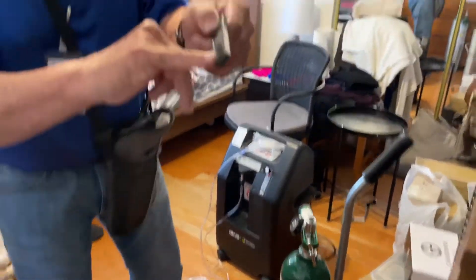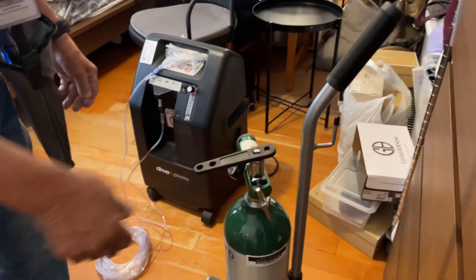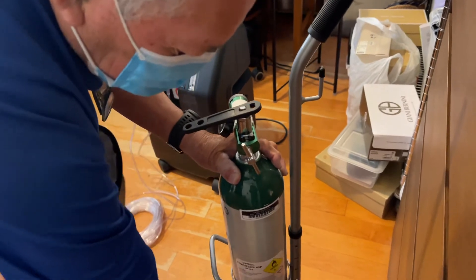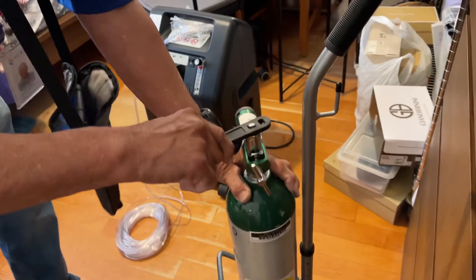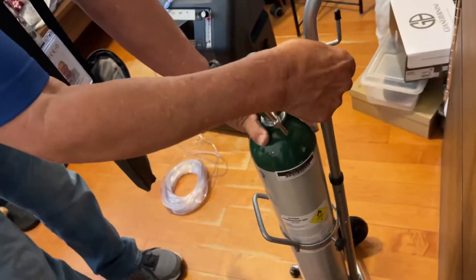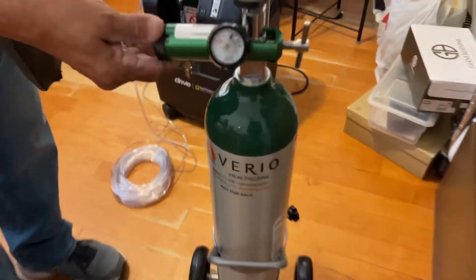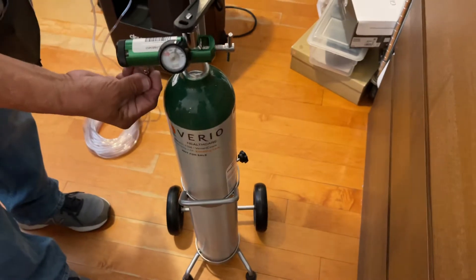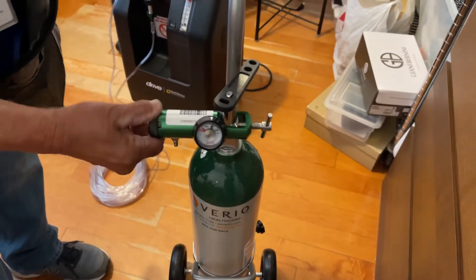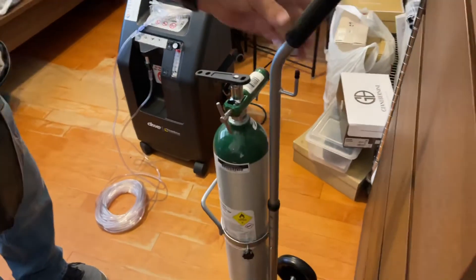Turn it on, hit the bar — turn it off. Set the flow to number two. This is where you're going to put your nose piece. Turn the regulator off to zero and then off — and that's it.